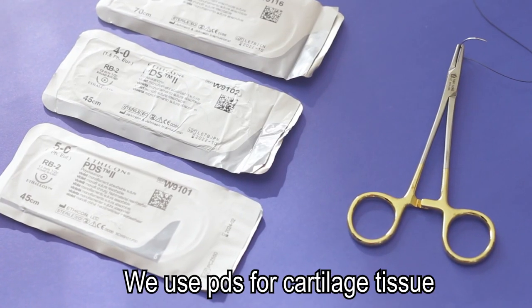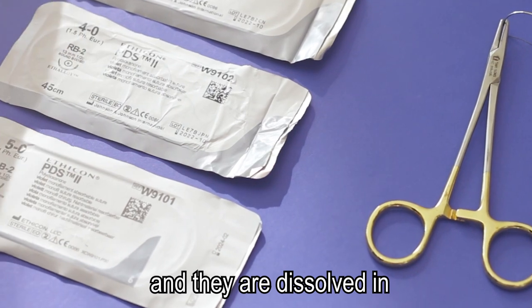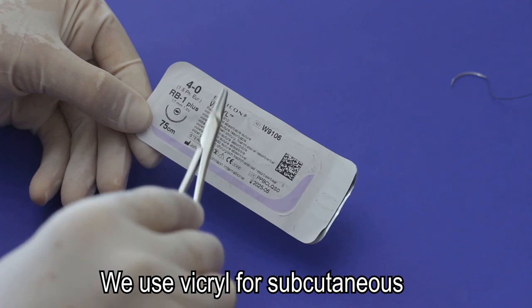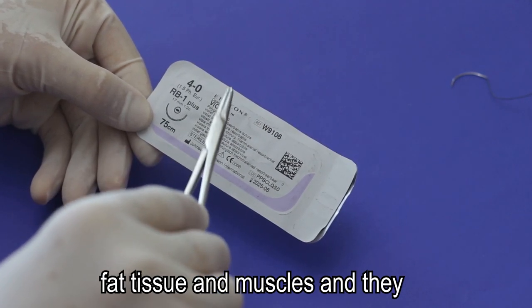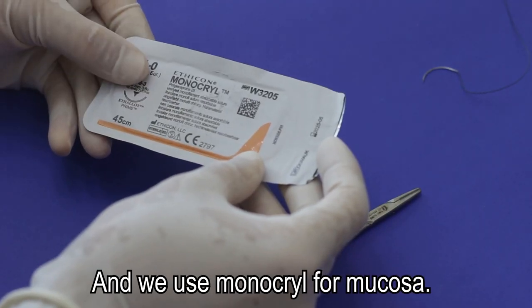We use PDS for cartilage tissue, and it is dissolved completely in 180 days from the body. We use Vicryl for subcutaneous fat tissue and muscles, and it is absorbed in 60 days. And we use Monocryl for mucosa.